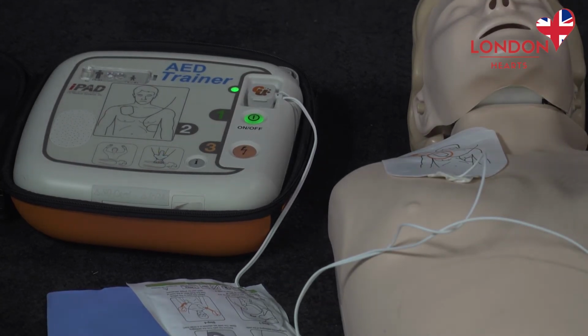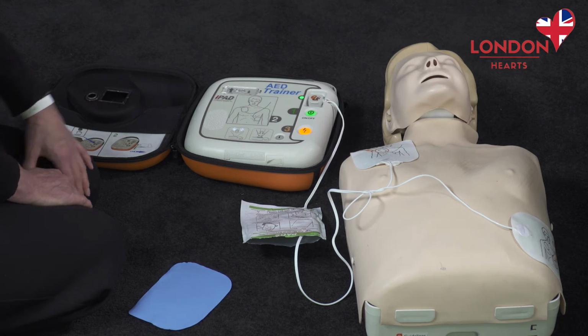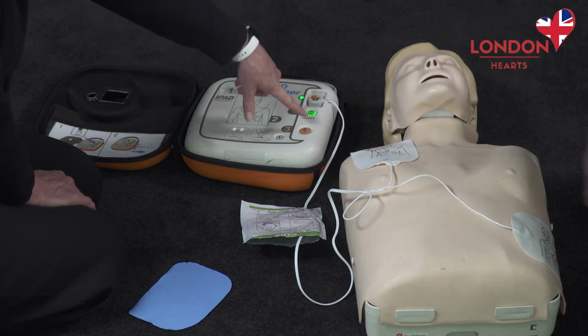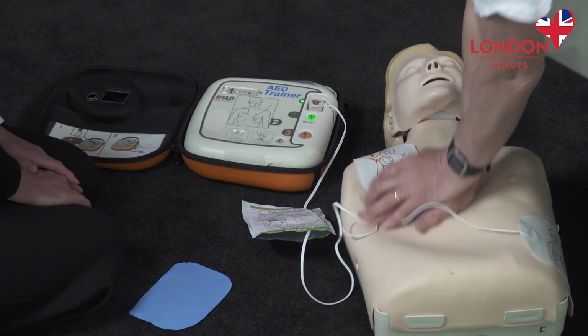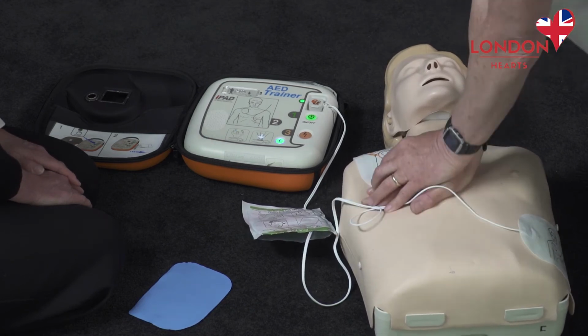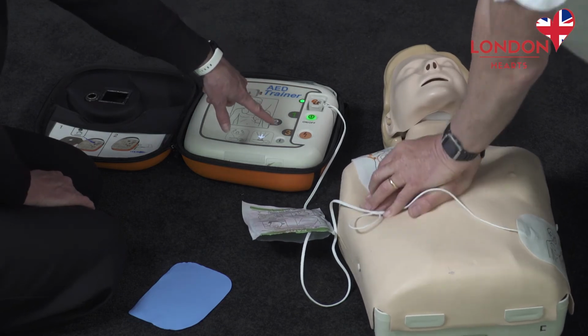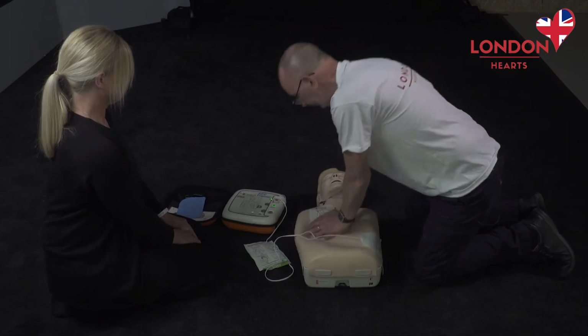Analysing heart rhythm. Shock advised. Stand clear. Press the flashing orange. Shock delivered. Begin CPR now. Press the flashing blue I button for CPR voice prompt.